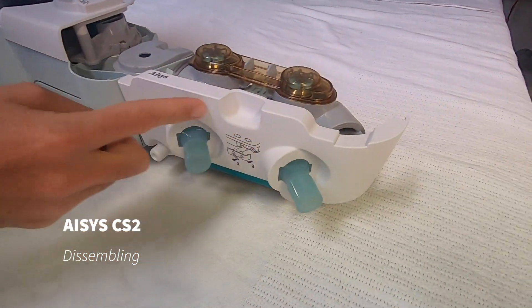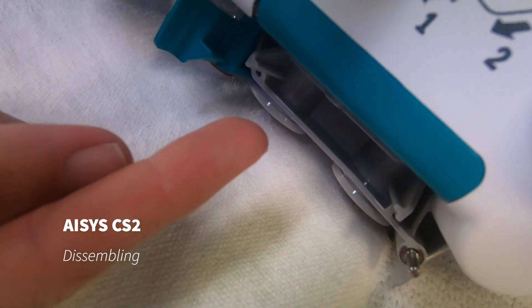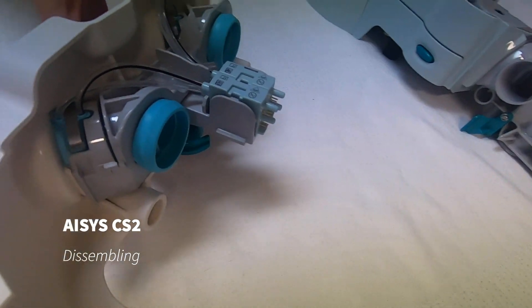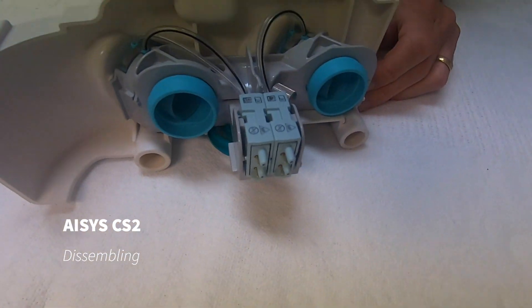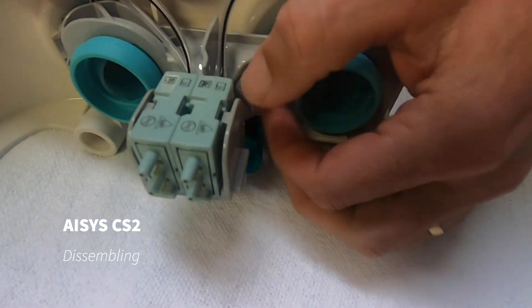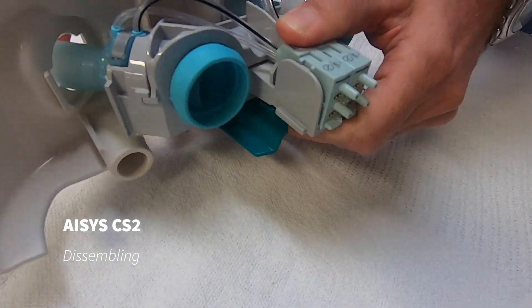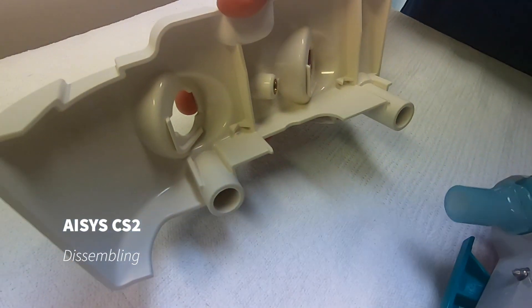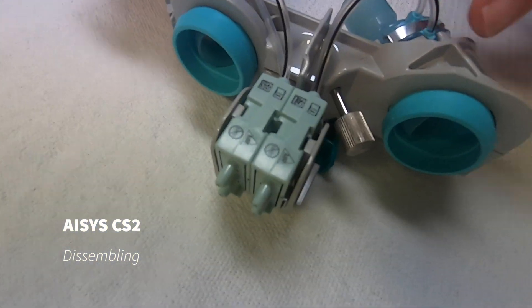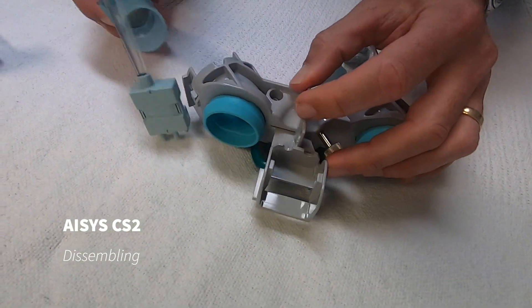Now I'm going to remove the airflow sensor assembly. There's a green lever underneath here — I'm going to pull that out and remove the airflow sensor assembly. I'll disassemble it now: the thumb screw here is unscrewed and we remove those pieces. The airflow sensors come out — they're lifted up out of the holder and just slide out.